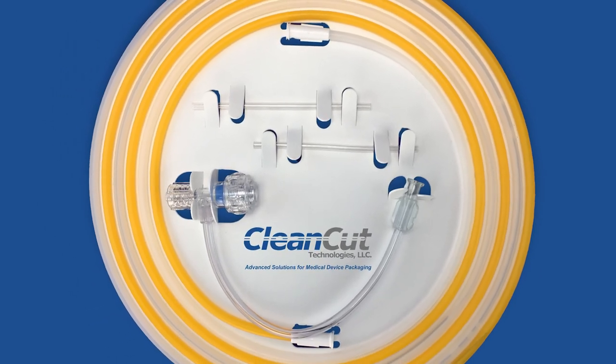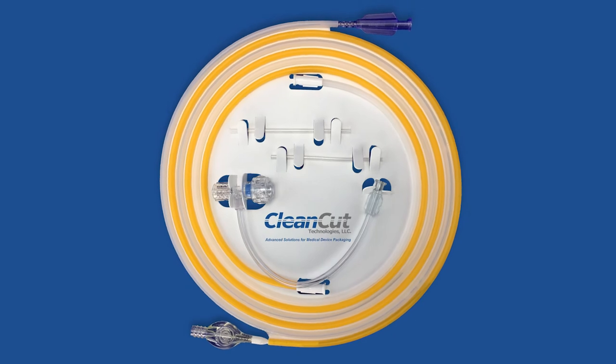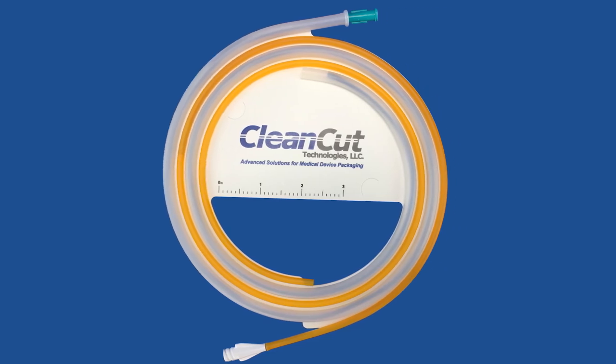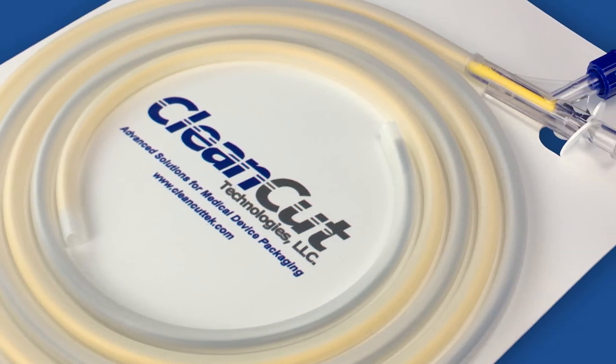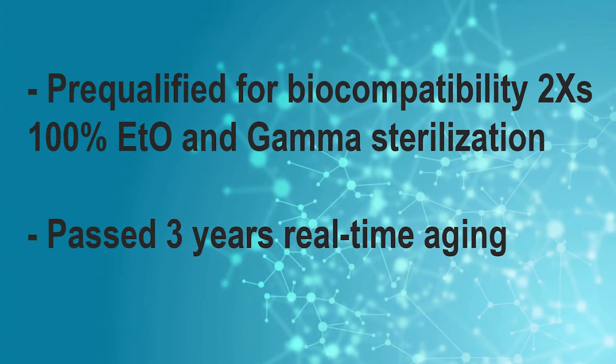Clean Cut has added to the efficiency of the DISC by adding a second coil tube to the backer card to offer the dual hoop catheter DISC. This entirely new packaging system for distributing different sized catheters and guide wires in one system eliminates the need for additional catheter packaging altogether.